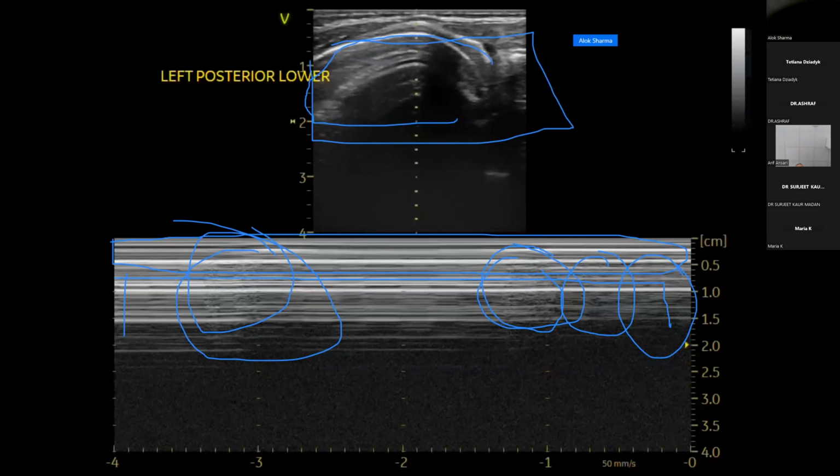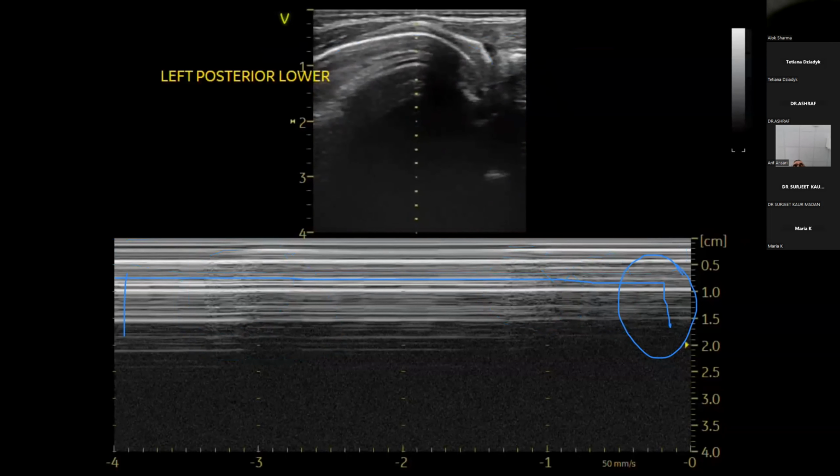So you can actually reduce your depth. So come back out, concentrate mainly on the pleura, go back to M mode for that zone over there. Or alternatively, you can reduce your frequency to get a better image penetration. If you're using an old machine, harmonics will not be a problem, but you might have to take two areas of focus. You might have to have an area of focus that basically looks at the pleural line and an area of focus that looks slightly deeper.